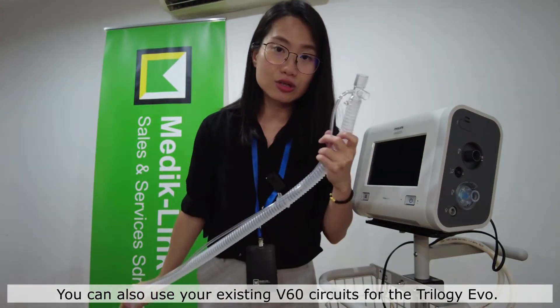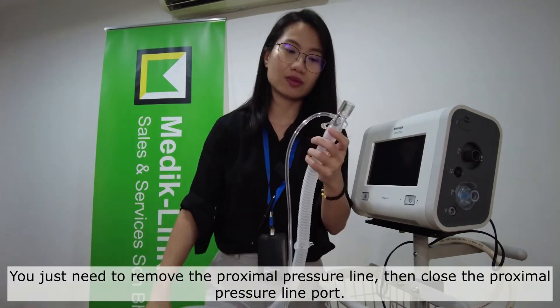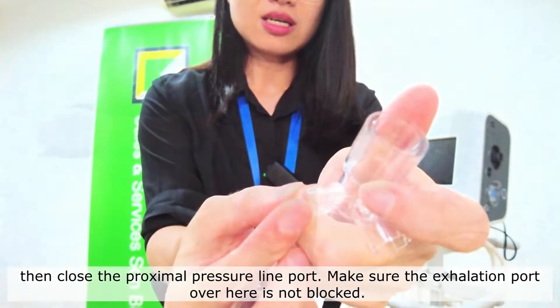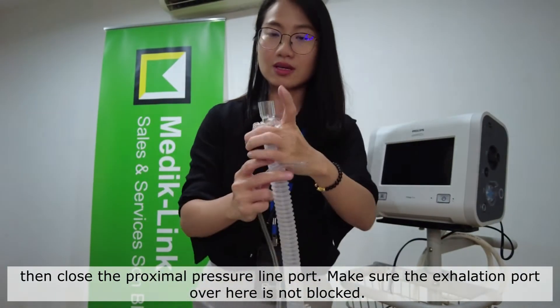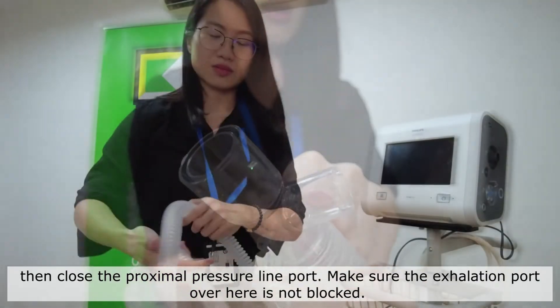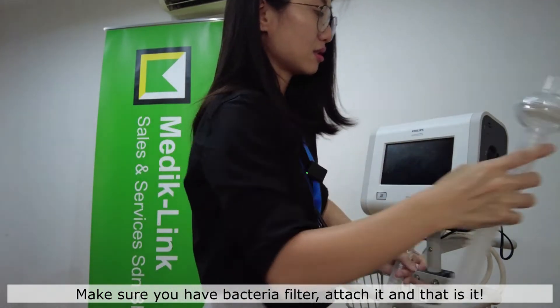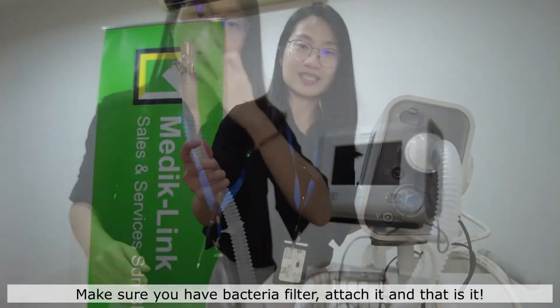You can also use your existing V60 circuit for the Trilogy EV300. You just need to remove the proximal pressure line and close the proximal pressure line port. Make sure that your exhalation port is not blocked and that you have a bacteria filter.